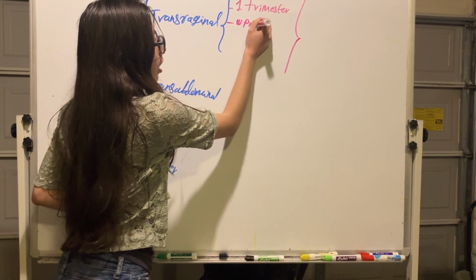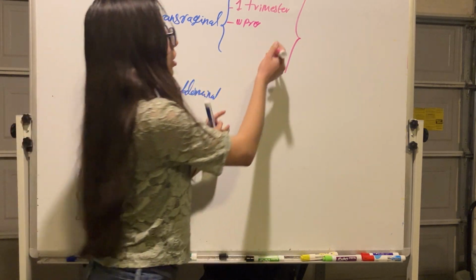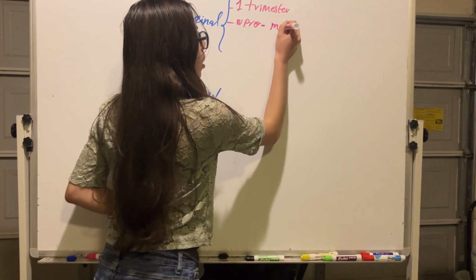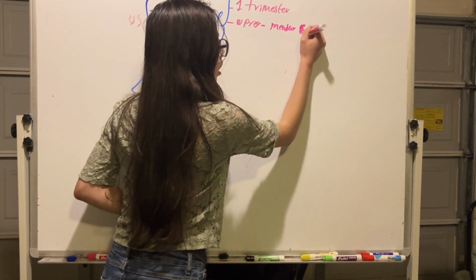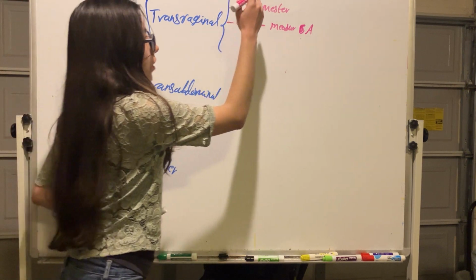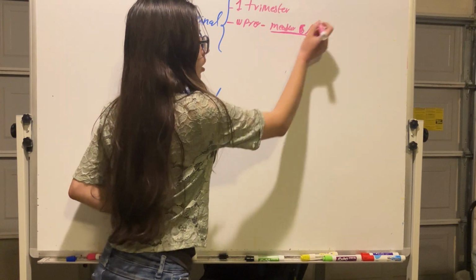pregnant this patient is during the first visit, and then that is going to be the measure we take for gestational age during the whole pregnancy. So the transvaginal ultrasound during the first trimester is the one we use to measure gestational age.